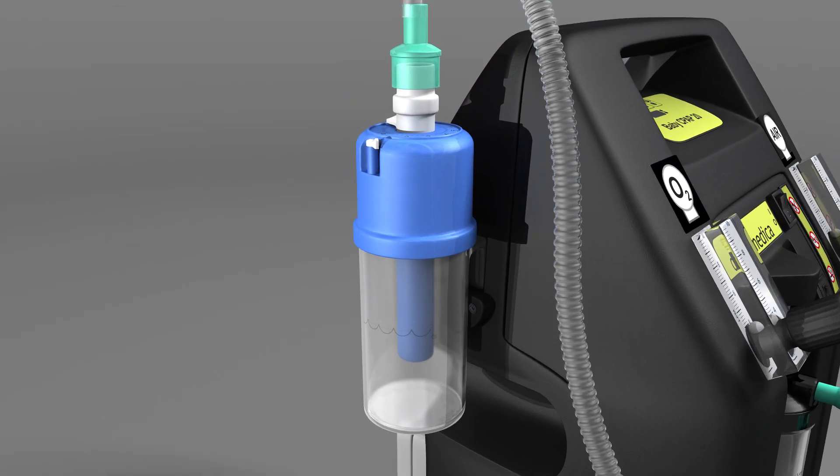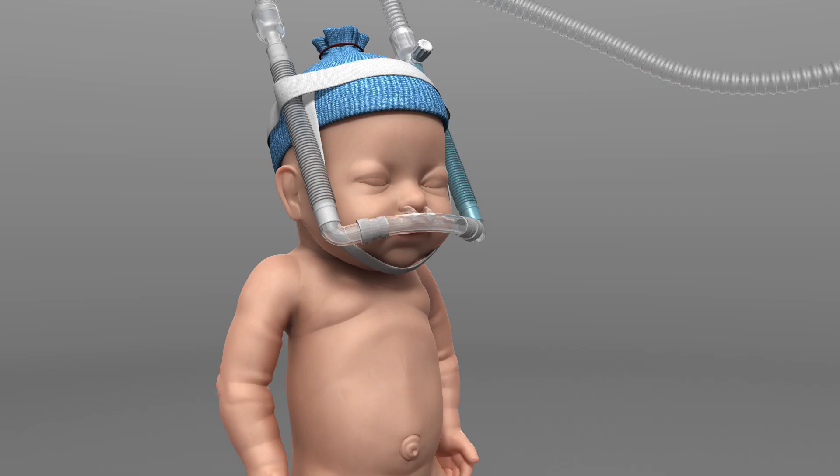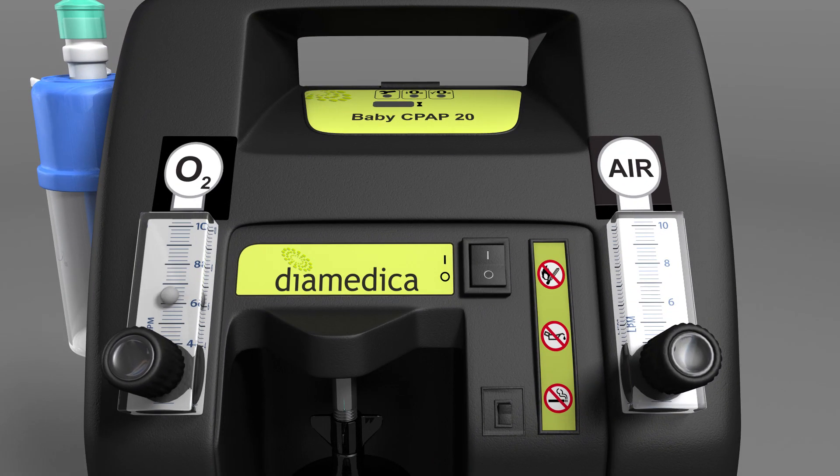Ensure there are continuous bubbles in the bubble bottle. If there are not continuous bubbles, check for leaks in the circuit and ensure the nasal prongs are fitted correctly. Additionally, you may need to increase the flow rate using the flow meters. Refer to the user manual for further information.